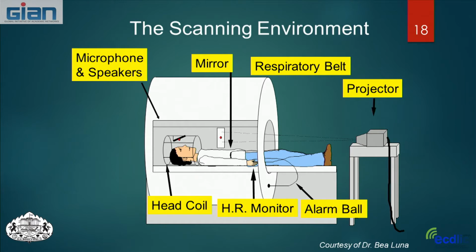And I always think this is sort of a paradox to our keeping them awake all night. If we do these sleep deprivation studies, then we get them all cozy and put them in this little scanner and tell them they need to stay awake. So you can imagine that people have a really hard time staying awake in there.